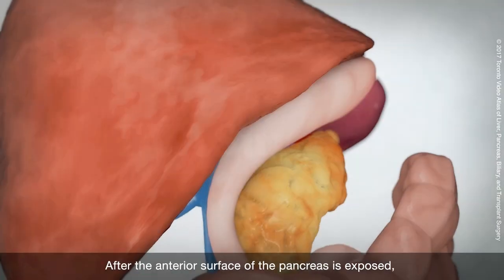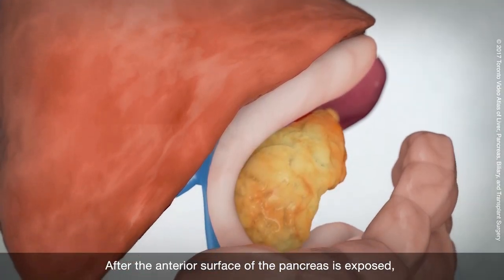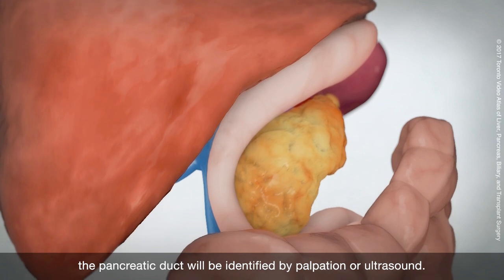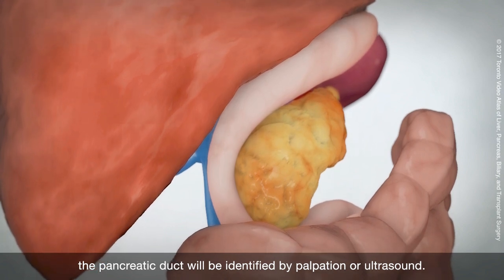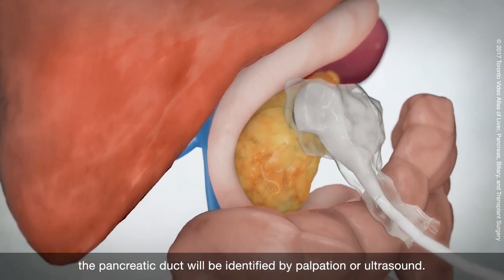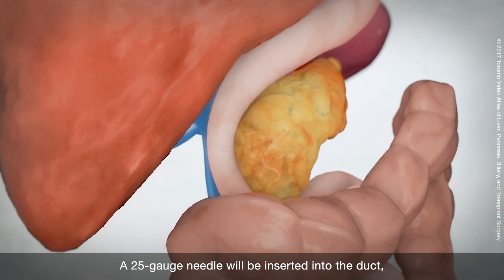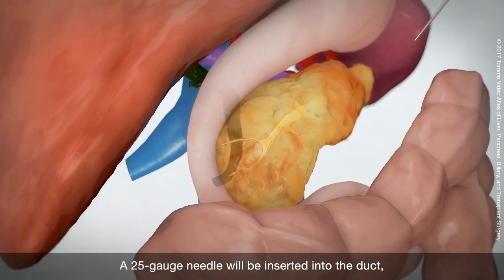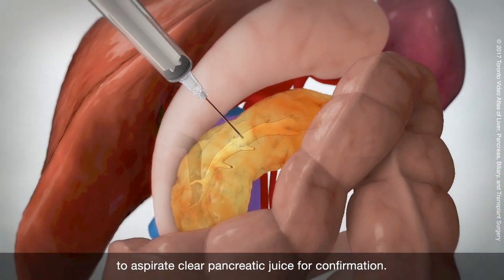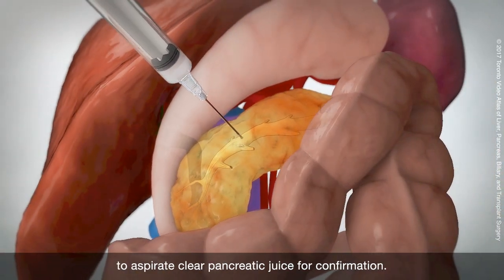After the anterior surface of the pancreas is exposed, the pancreatic duct will be identified by palpation or ultrasound. A 25-gauge needle will be inserted into the duct to aspirate clear pancreatic juice for confirmation.